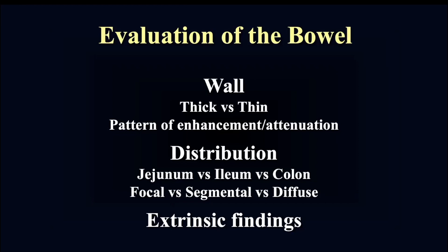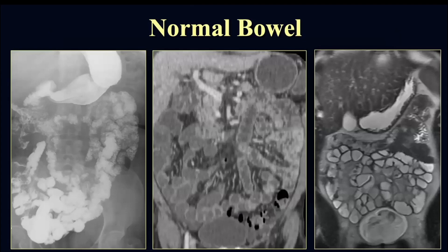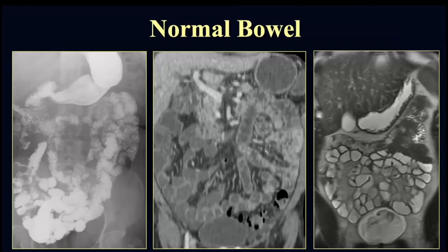Before we get too deep into the weeds, remember we always need to take a step back and decide what is normal. Here you'll see a small bowel follow-through fluoroscopic examination, a CT coronal view, and an MR T2-weighted coronal view of the bowel. I like to use this image to emphasize the value of coronal imaging when evaluating the bowel, because you see much more bowel on a single image, making you more sensitive to detecting abnormalities in bowel caliber, wall thickness, and enhancement.